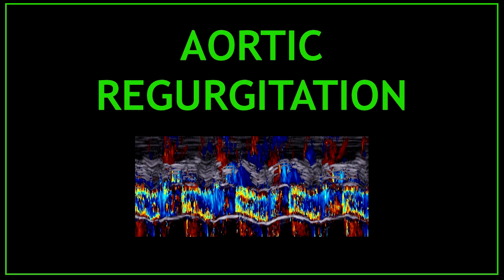In this video we are going to talk about aortic regurgitation.